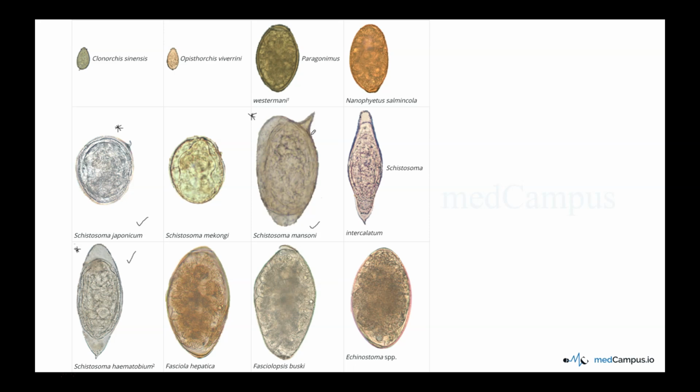Can I say spine? This looks like a spine, right? Till now we were discussing pole or knob or filament, and hooks in Taenia. So these are the four things which help you in differentiating, and also the shell covering it, thick and thin shell, and also the operculum.